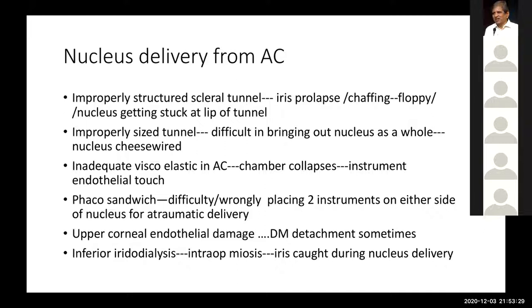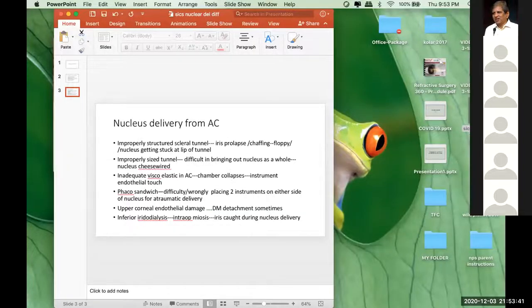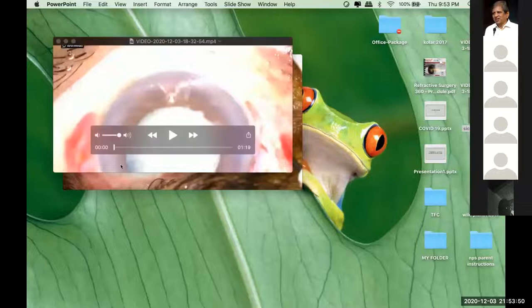These are the few points which I've noticed during the course of my teaching at Minto Hospital while teaching the postgraduates, the difficulties a postgraduate faces while delivering the nucleus from the eyeball. I'll just try to play a small video which my postgraduate just sent a couple of minutes back. I'll just try to play that video.